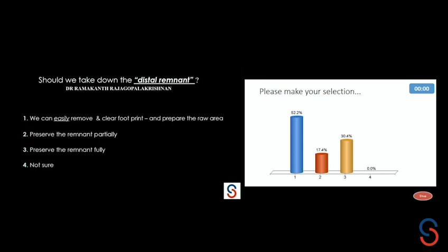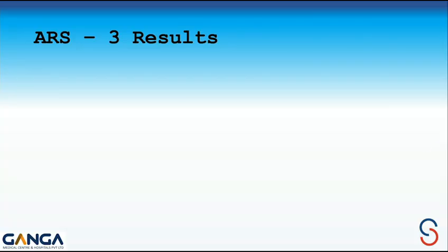I would preserve the distal stump, but it does not add biomechanical strength. So you want to use your medial stump, both layers, and do a double row. But while passing through the double row, you pass through the lateral stump as such, so you have got some collagen there. Yes, sir, for whatever reason. That's the important thing. These are collagen tissue which adds to the thickness. Otherwise, the cuff would become very thin.